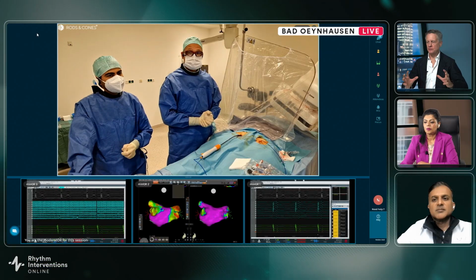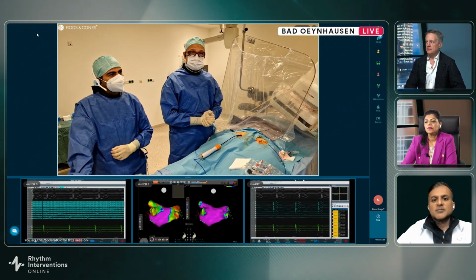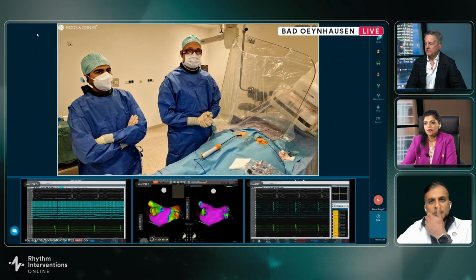Brilliant. Well, we're coming towards the final minutes. Perhaps I can ask Kousik to sum up where he sees this particular technology fit in with the other PFA technologies. Where does it fit into your practice?